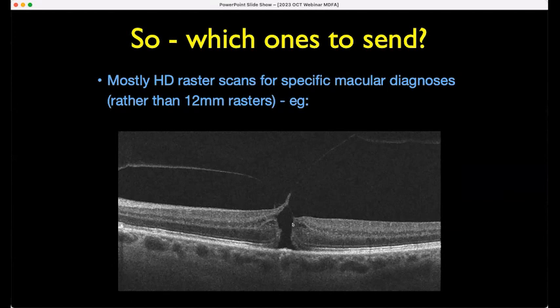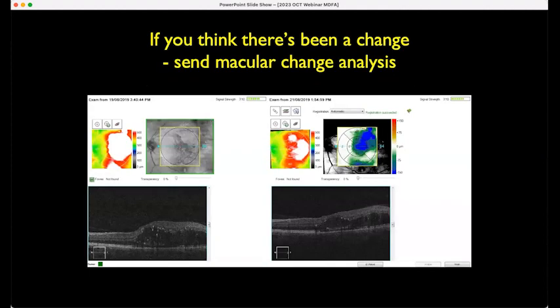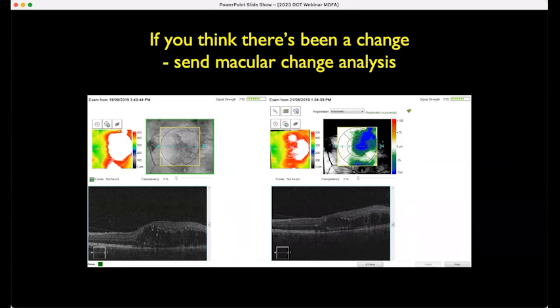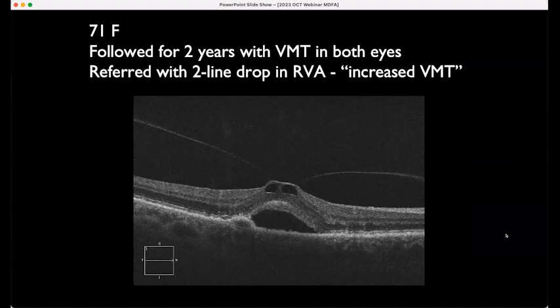You need to send something with decent magnification showing the pathology in question. Sometimes you need to narrow the spacing between scans to catch something like a small macular hole. If you think there's been a change — for example, a patient with an epiretinal membrane — sending a macular change analysis gives the receiving ophthalmologist a good idea of the tempo of changes when they haven't seen the patient before.